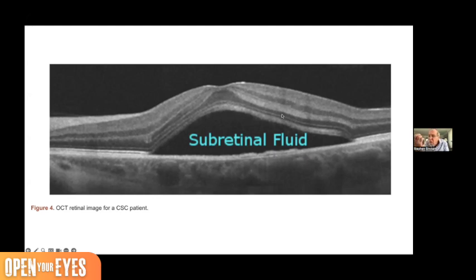So what's going on in the neurons and the microvasculature and the health of these, besides just the loss of the pigment epithelium here. And we recognize with this chronic fluid, even though this subretinal fluid looks pretty clear, it does cause chronic loss, retraction, and death of the pigment epithelium. So these are things that we need to analyze better, think about.